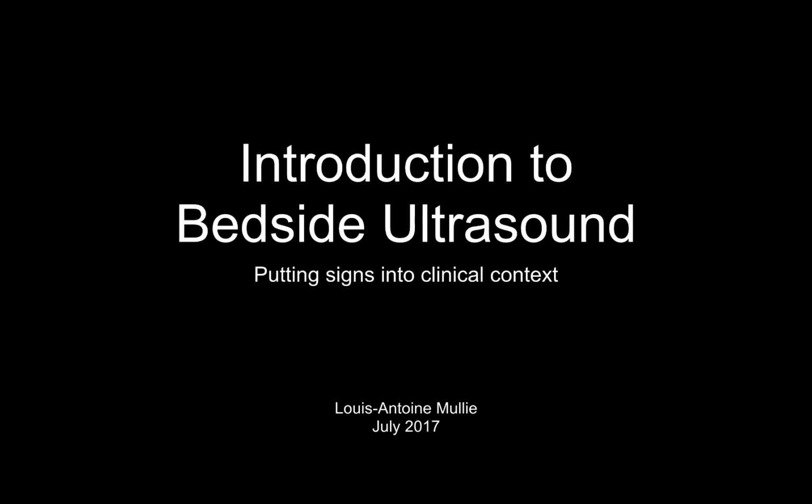Hi, my name is Louis and I'm a medical resident at the Royal Victoria Hospital, and this is the Introduction to Bedside Ultrasound online capsule. With this online session, I hope to stimulate interest in bedside ultrasound. I think we're all aware that it's an increasingly important skill to develop.